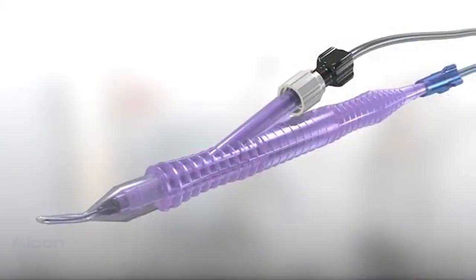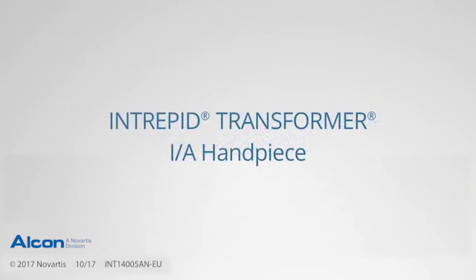The Transformer I/A handpiece. A new idea in cortex removal.